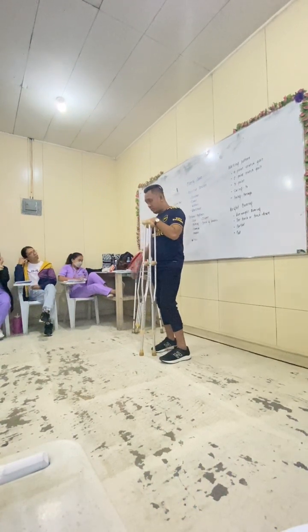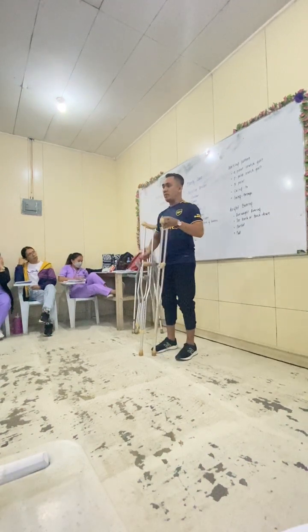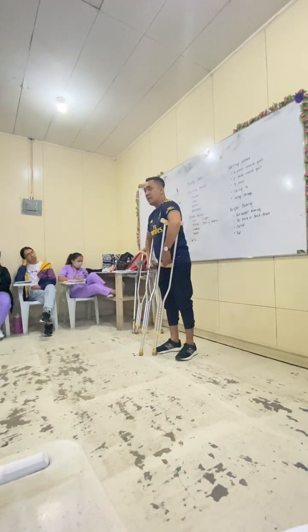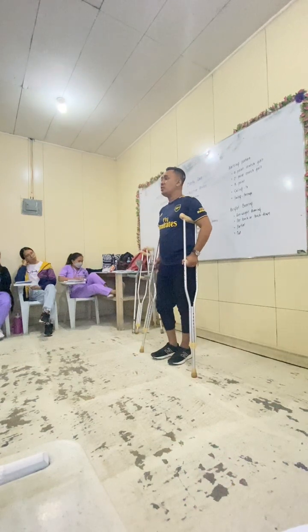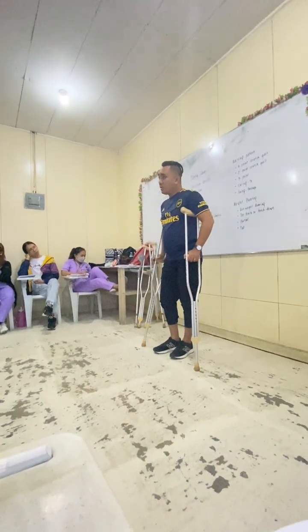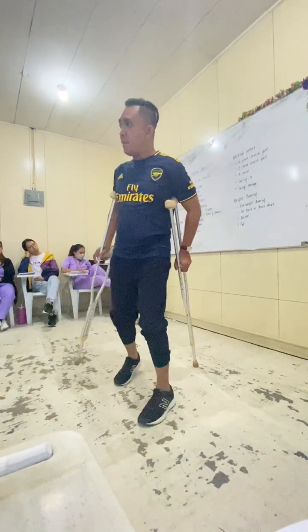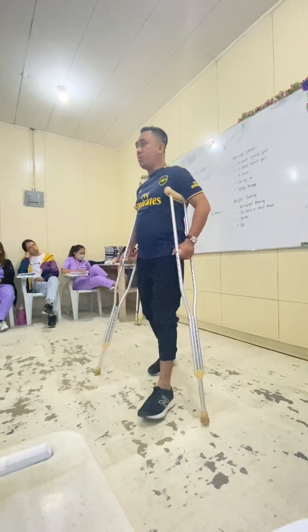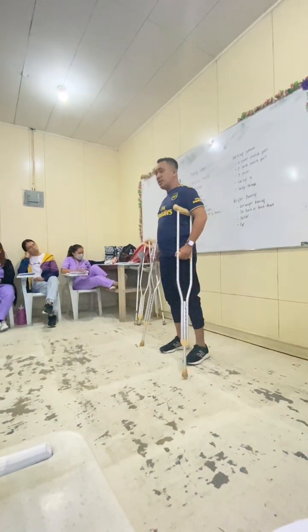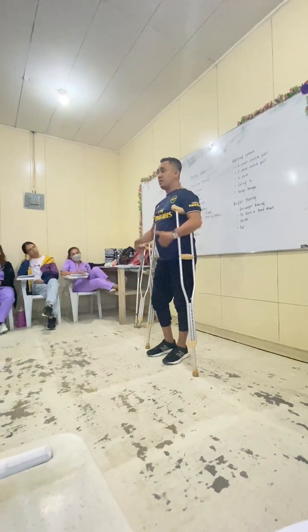When we say weak, like losing of muscles, which means that when a patient walks, they really need assistive devices. Another issue is poor coordination. Okay? Or dili balance ang ilang pagkakaw. So to prevent this, na ma-accidente ang inyong patient, then they will be using axillary crutches.